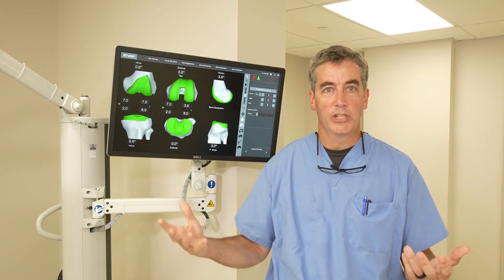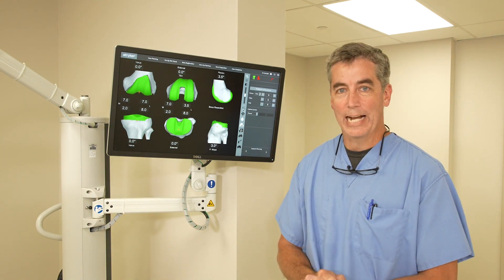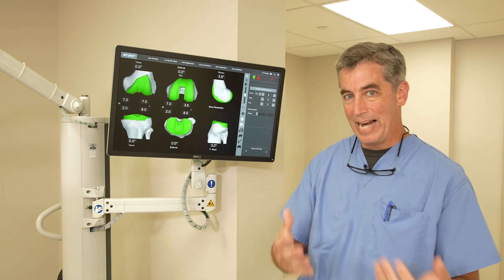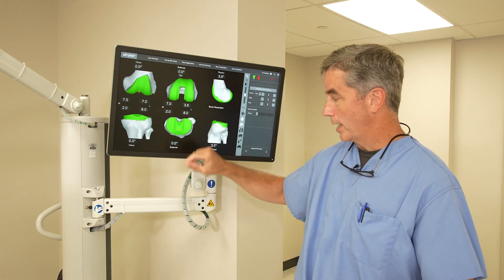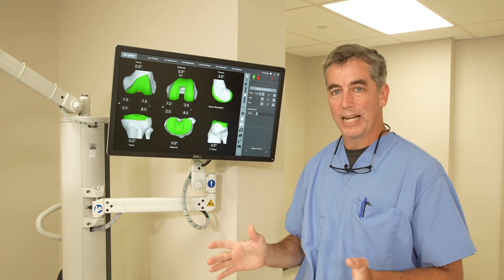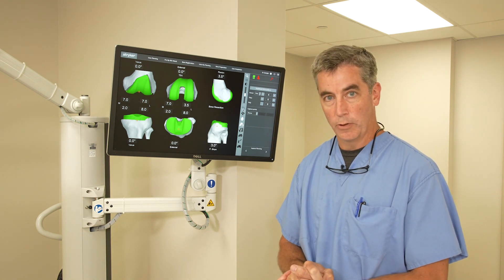Before the patient even comes into the operating room, in the surgical planning stage, they get a CAT scan performed of their knee that allows us to plan the surgery. That CAT scan is uploaded into this computer system and allows us to plan for the sizes and the initial orientation — though that's typically not the final orientation, because we do take into account the ligaments and so forth when we're doing the surgery.